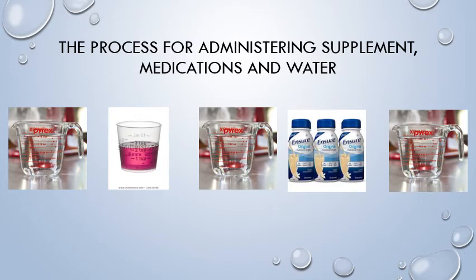Remember, feeding tubes that are continuous, gravity or pump, will need to be turned off and the tube flushed with water prior to administration of medication via the same feeding tube port. The delegating licensed nurse will provide you with instructions on how to do this. The delegating licensed nurse will provide specific instructions for positioning of the individual and how to verify tube placement for the individual. The process is always the same.